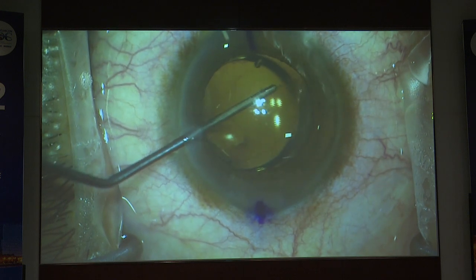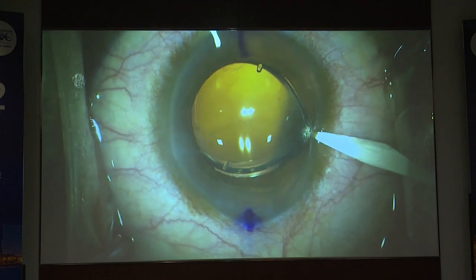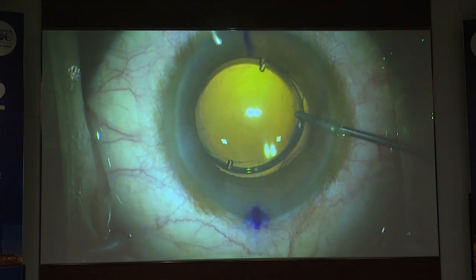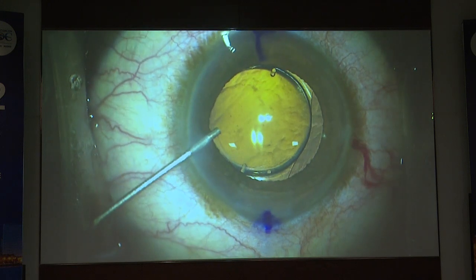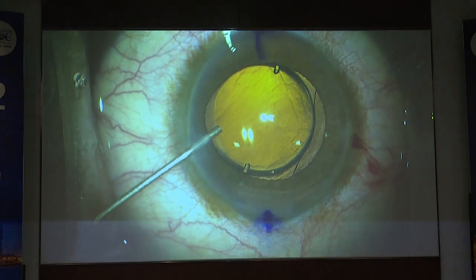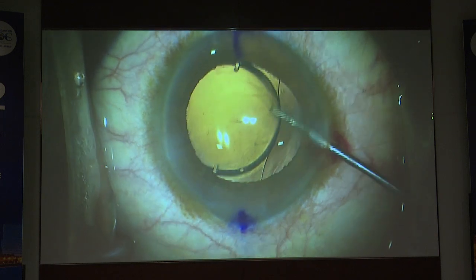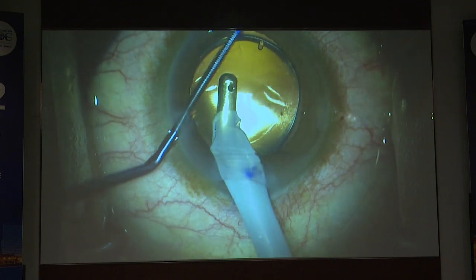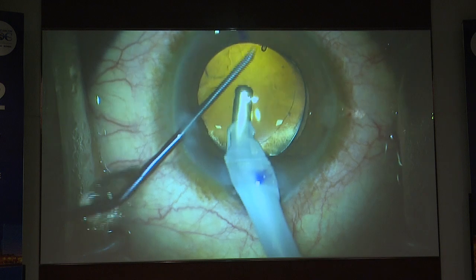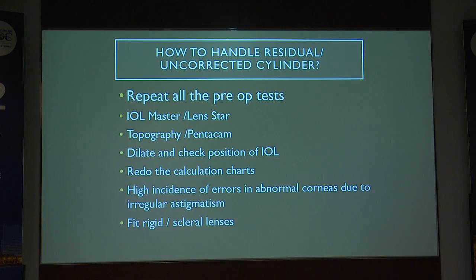Once we rotated the lens — these are plate haptic lenses — within two days we realized what we did wrong. We rotated the lens to the 0-180 degrees marking. It's quite easy to shift these lenses because they are plate haptic. You have to be a little careful about not injuring the posterior capsule. After rotating, the next post-surgery showed the patient had a good refractive outcome: minus 1.5.